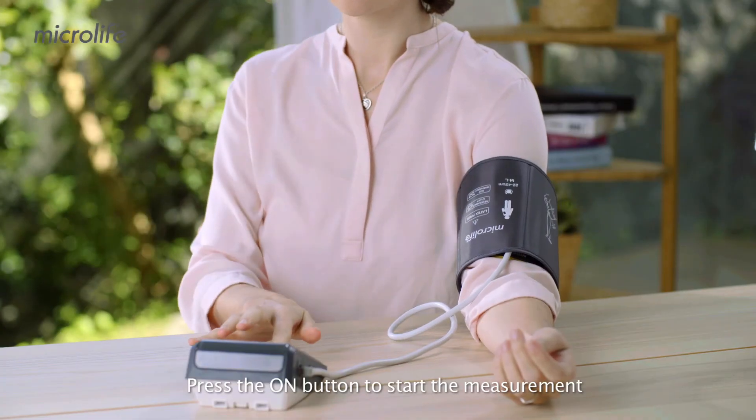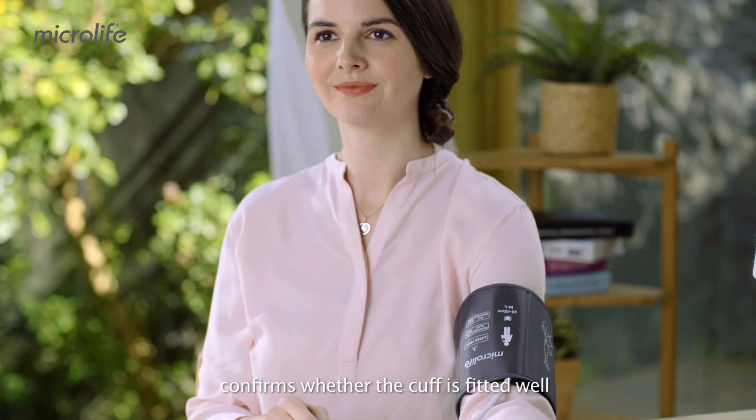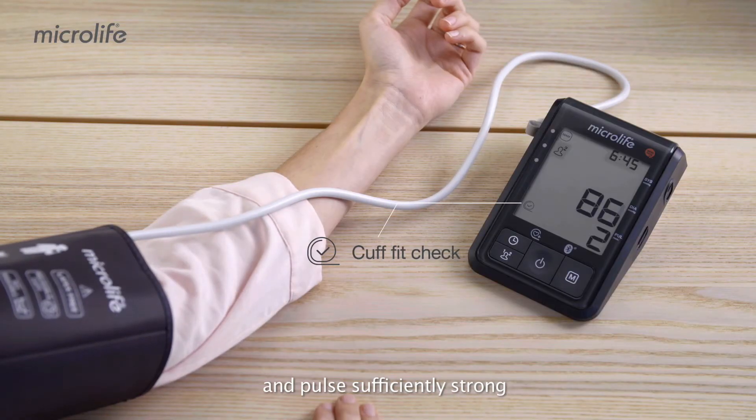Press the On button to start the measurement. A moment later, a check mark in the cuff symbol confirms whether the cuff is fitted well and the pulse is sufficiently strong.